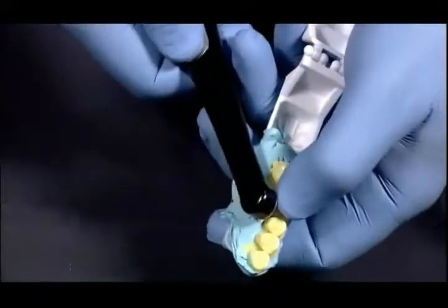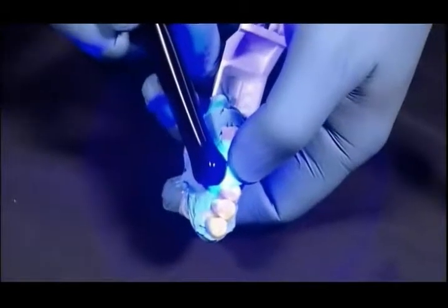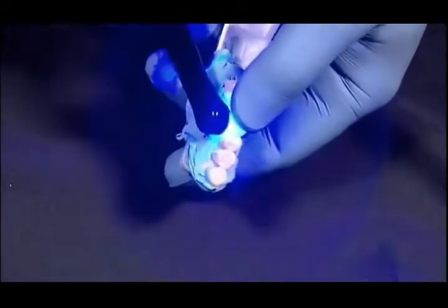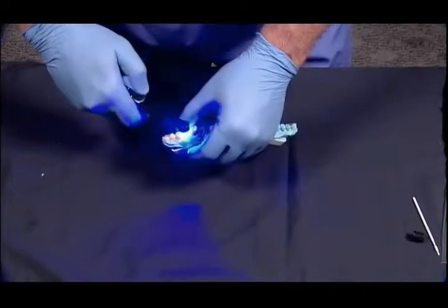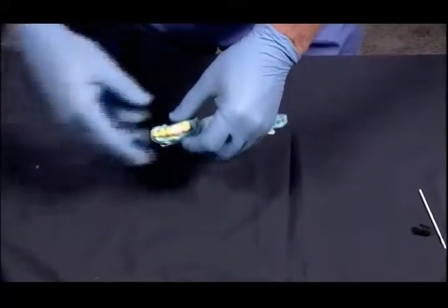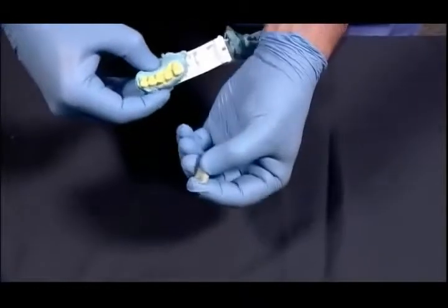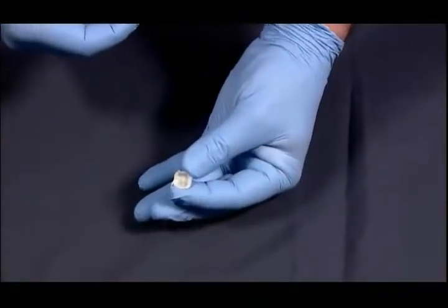All right, that is about as good as we need it to be for us to go ahead and cure it. So you're going to cure all aspects of this for 10 seconds on the buccal, 10 seconds on the lingual, 10 seconds on the occlusal. You're going to spend some time on the interproximals. Now that we've finished our curing, what we'll do is remove the hardened crown shell, and I will turn that towards you so you can see the marginal integrity that we have.